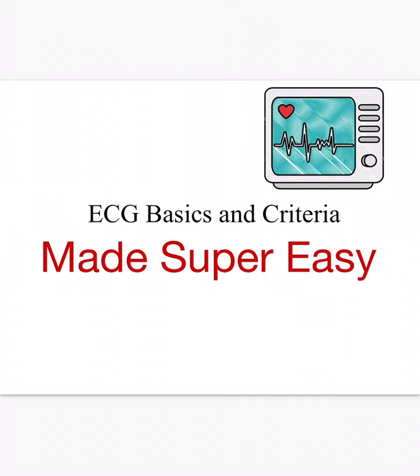ECG is one of the most confusing topics. So let's see how we can make it easy and get the questions correct. This is the aim for today.